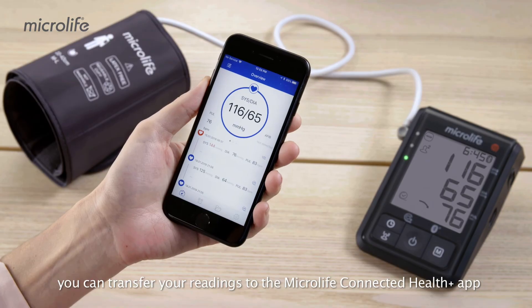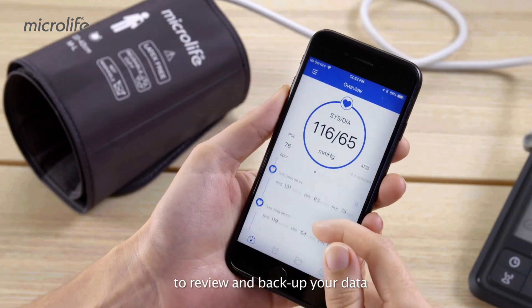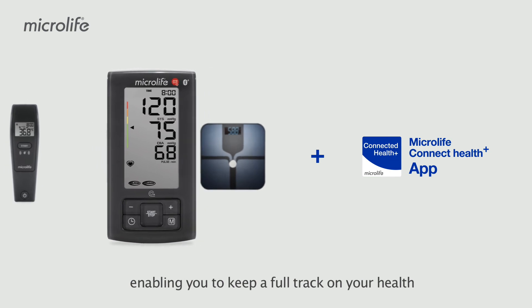With the Microlife B6, you can transfer your readings to the Microlife Connected Health Plus app to review and backup your data. Discover the wide range of the connected product world of Microlife, enabling you to keep full track of your health.